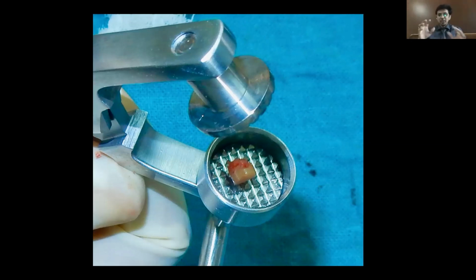Are you getting the point? Because of that simultaneous bone grafting, naturally the waiting period would be more. Instead of 3 months, you have to wait a minimum of 4 to 5 months. Then only you can load the implant. Are you getting my point? So, how many days?